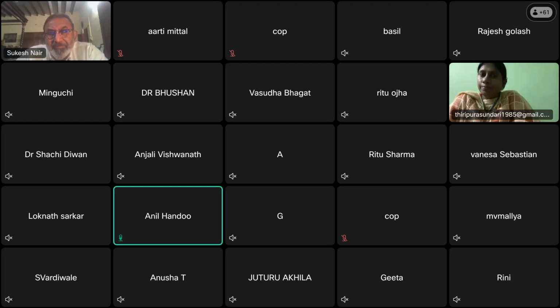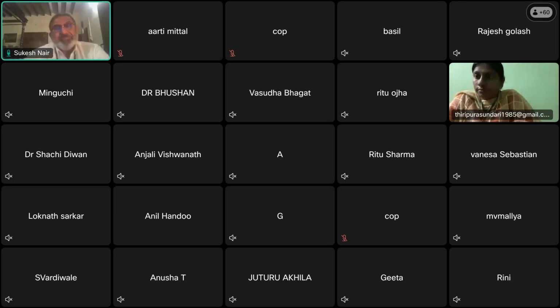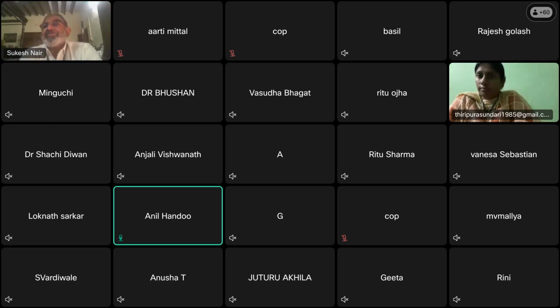Generally speaking, if we take samples together and put them through the analyzers at the same time, maybe within the first 2 hours of collection, we shouldn't find a significant variation in MCV. Not at all. Absolutely.